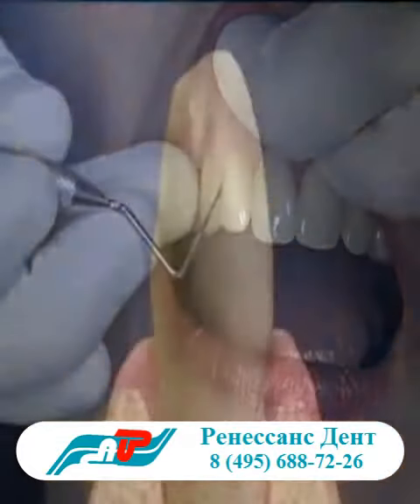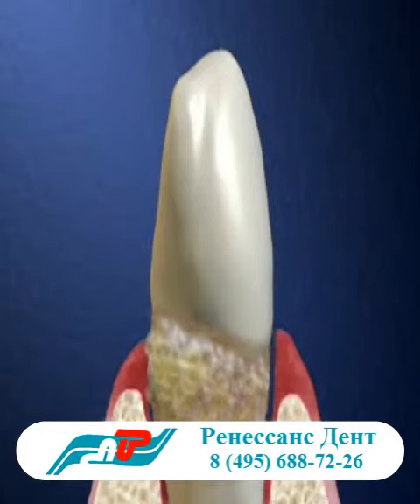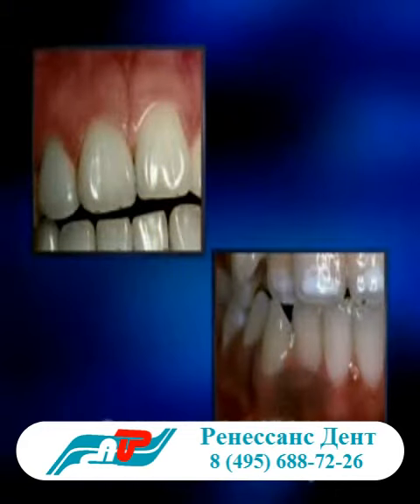When the bone level falls, the gums pull away from the tooth, forming a pocket. We measure the depth of this pocket with a periodontal probe. The measurement is from the bottom of the pocket, where the gum is attached to the tooth, to the top of the gums. These are healthy gums. They're tight against the teeth, and there aren't any pockets.